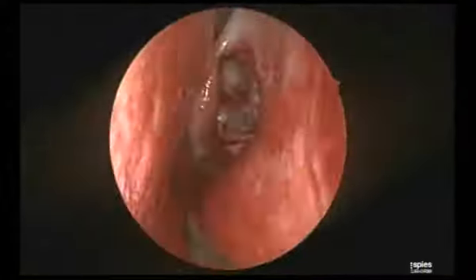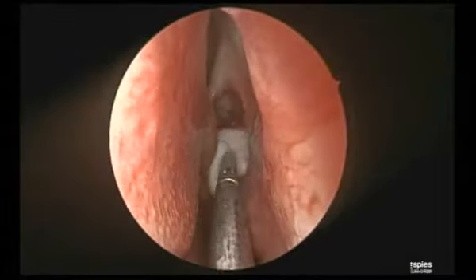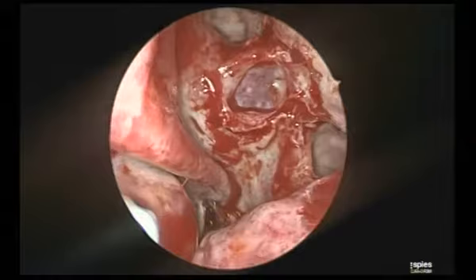So I don't look for the Haller cell in the beginning and confuse myself. Just leave it and come to that point at this point of time. That makes your life so easy. See now, why I identified this maxillary line? I told you this is a surgery of landmarks.